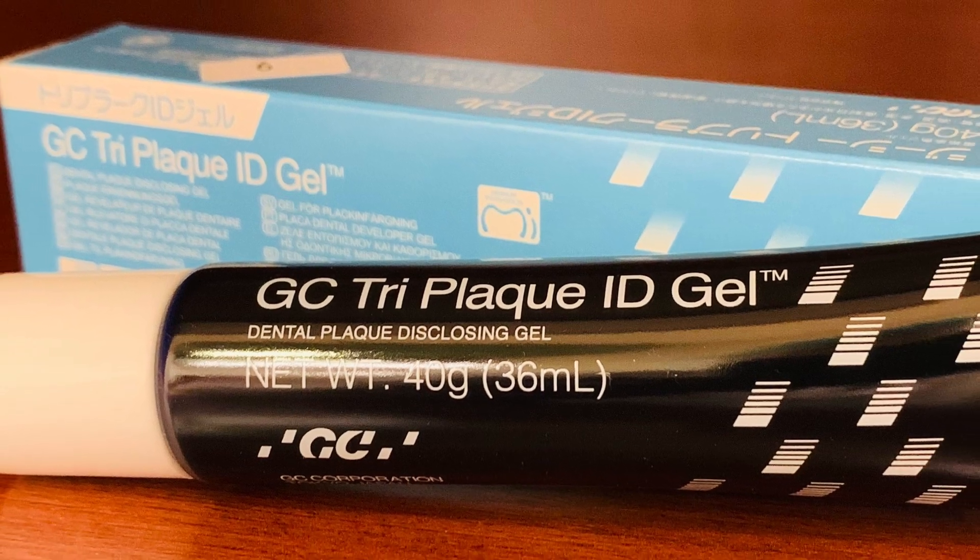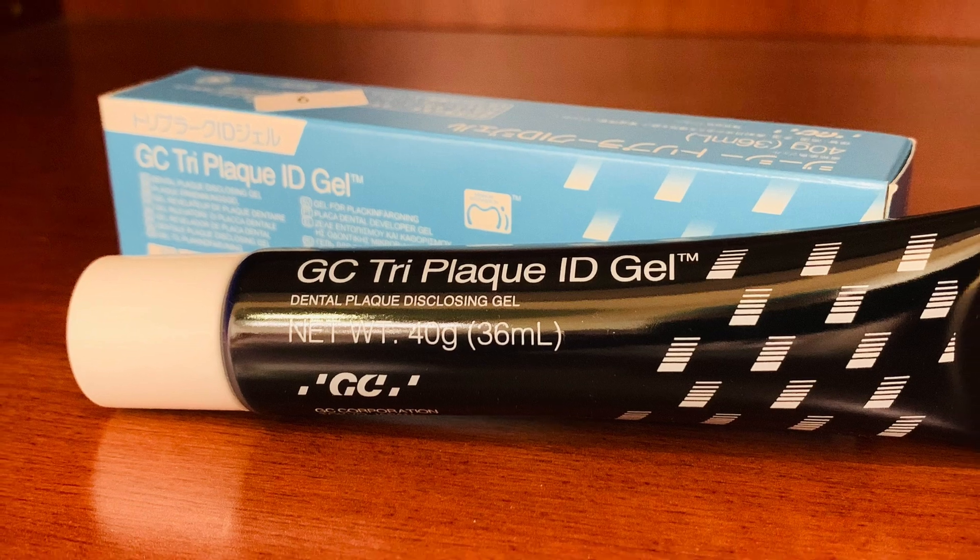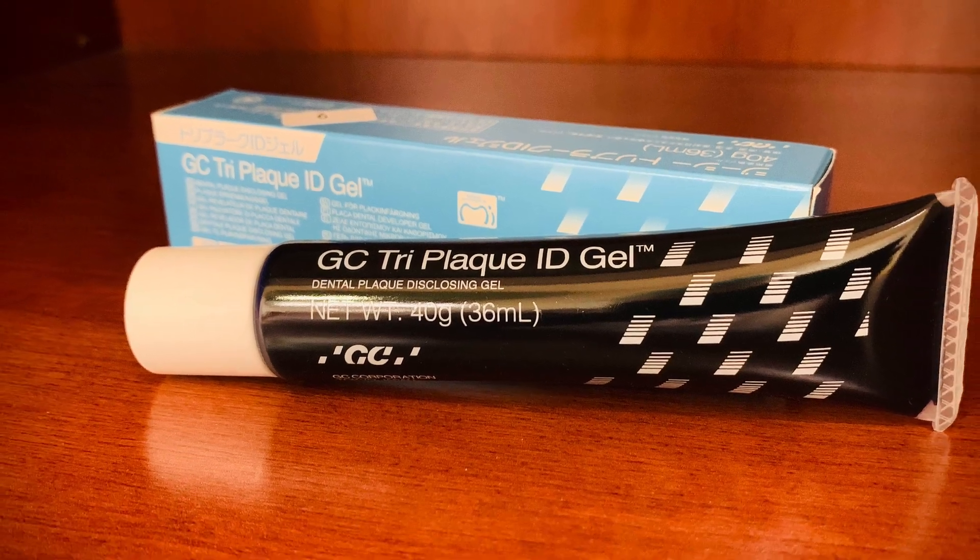GC Tri-Plaque ID Gel enables patients to clearly see areas where they need to focus and enhance their brushing and flossing habits. This innovative plaque disclosing gel reveals new, mature, and acid-producing biofilms in three distinct colors.